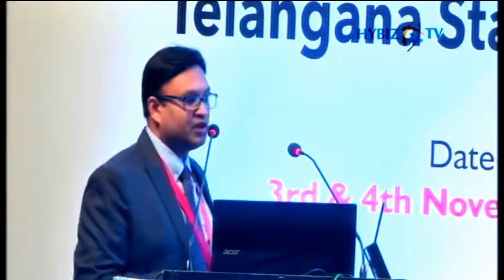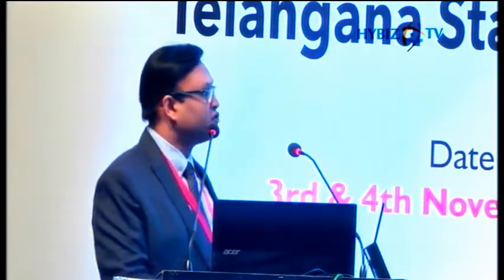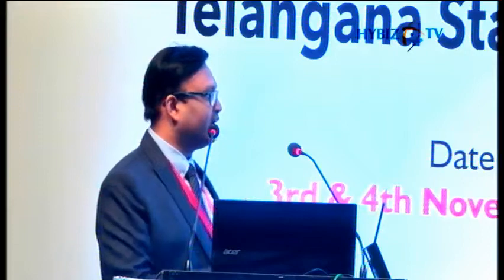For Doppler, they have also said that we should know about the velocity scales. We should optimally use the velocity scales, with the sweep speed normally at 100 millimeters per second. We should have an adequate sample volume size. We should use the wall filters and the proper gain, and use tissue Doppler imaging to get better images. I'll come to each of these.